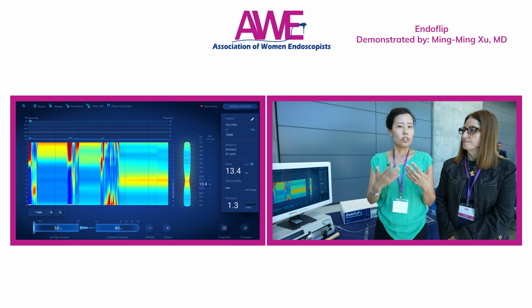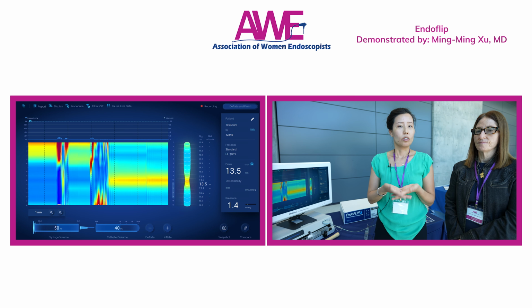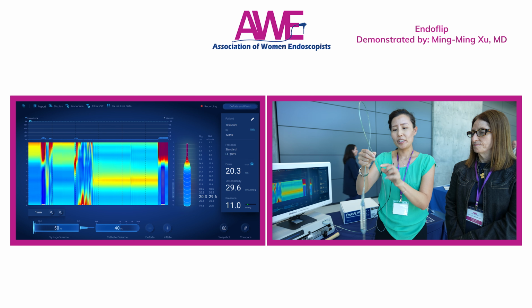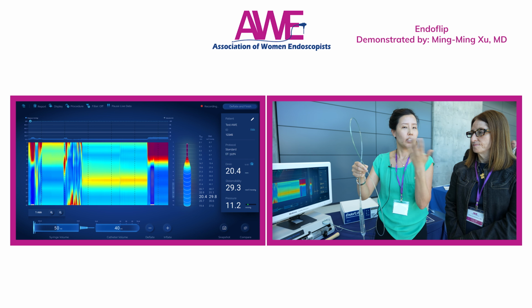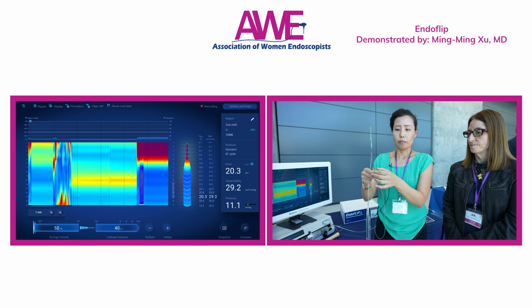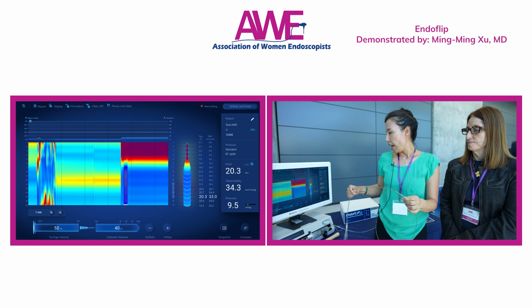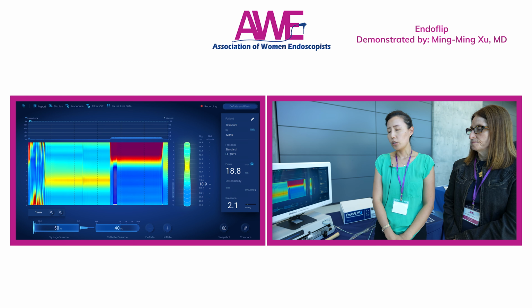And you always want to know, based on your pre-endoscopy, what the measurement of the lower esophageal sphincter is. Then there are markings on the device, although they're small, but you can definitely find the centimeter markings, and usually the LES you expect to be about 40, 45, so you put a piece of tape around it, that's how I do it, and measure where the LES is, and you insert the balloon up to that level. And then you subsequently inflate that balloon to the pre-desired volume.